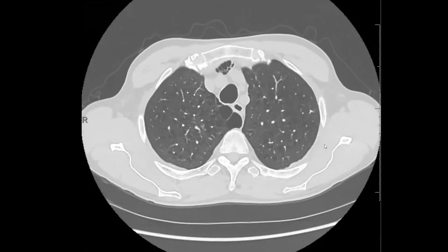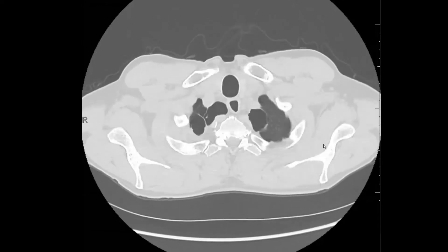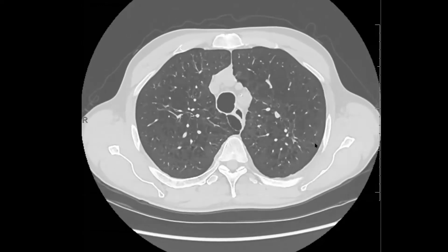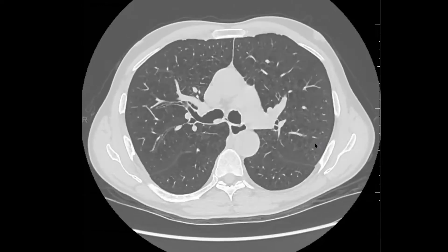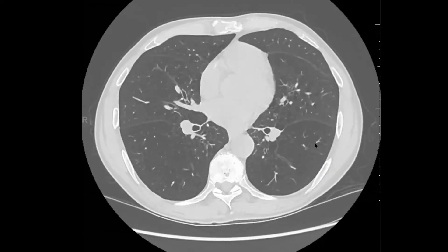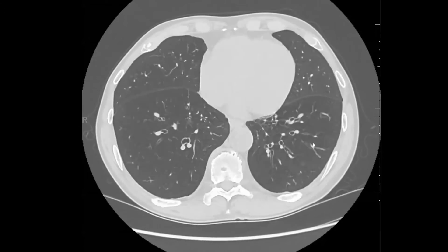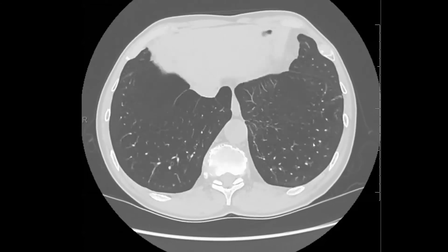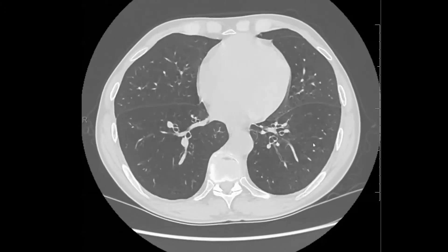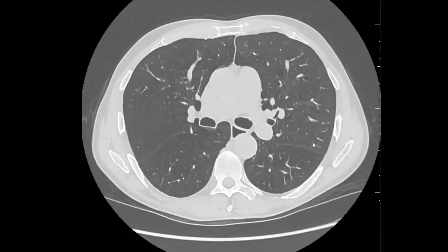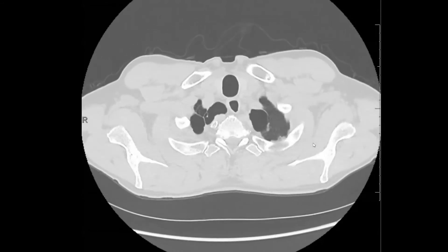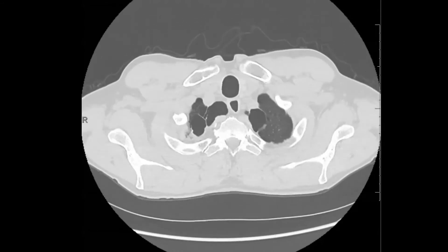Here's an HRCT but there's no fibrosis here, no interstitial lung disease. We're really seeing a lot of emphysema, and I thought it'd be a nice opportunity to talk about the different types of emphysema.